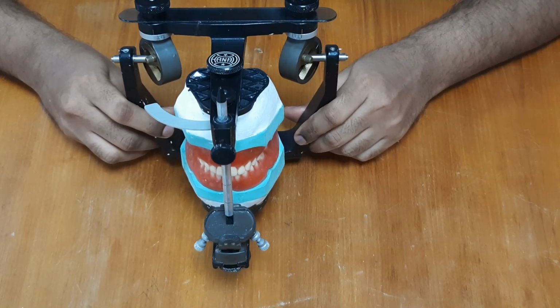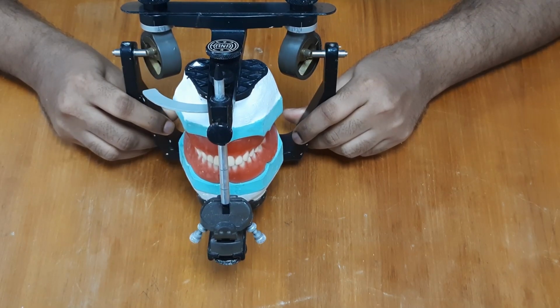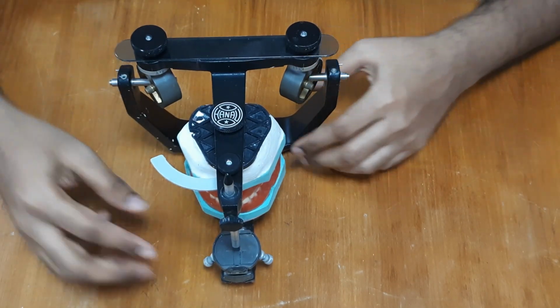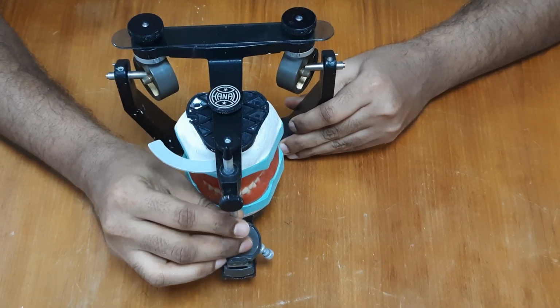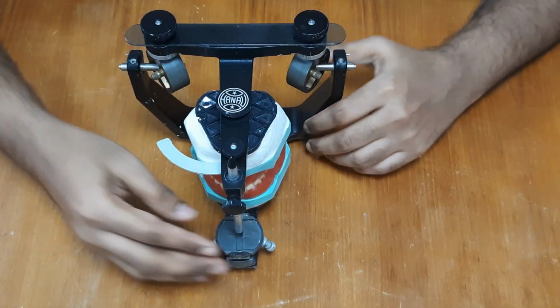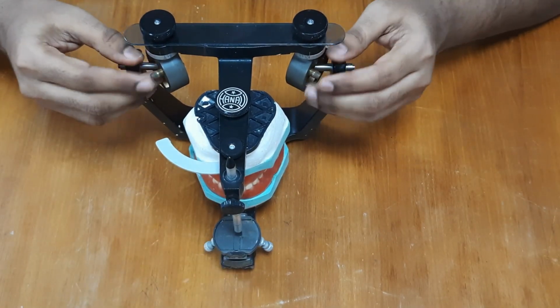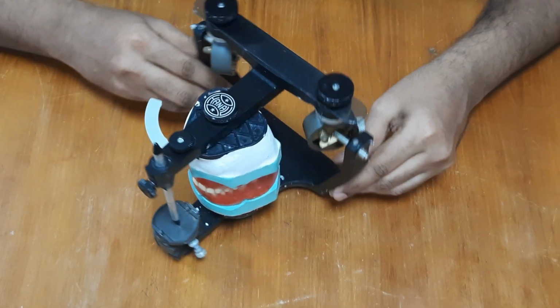This is a Hanau wide view articulator. It is an example of a semi-adjustable articulator and it is the most commonly used articulator. It accepts face bow transfer and it is capable of hinge movement and lateral movement. Now we will see the parts of this complex design.